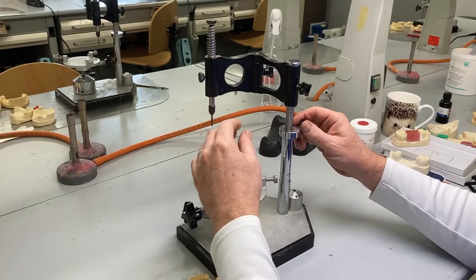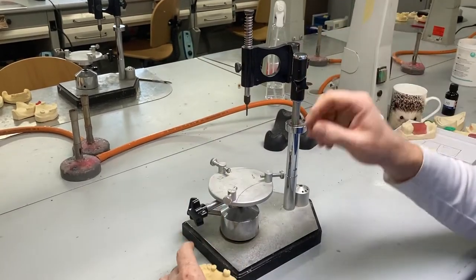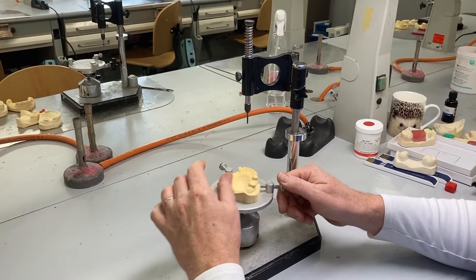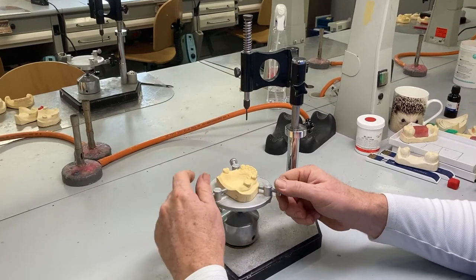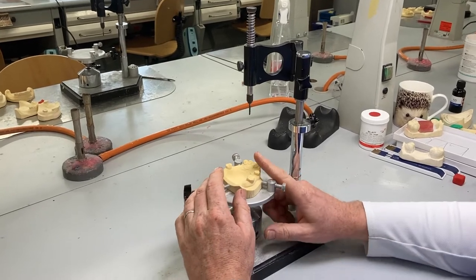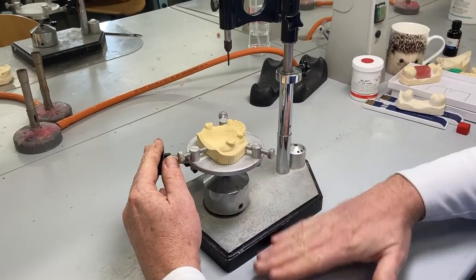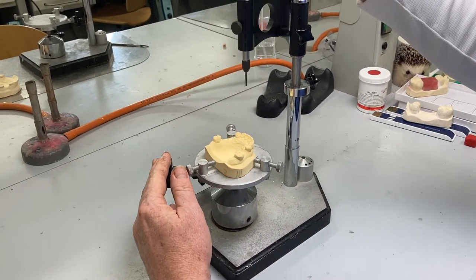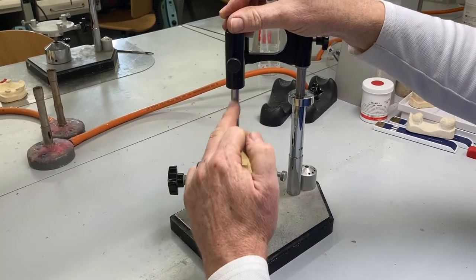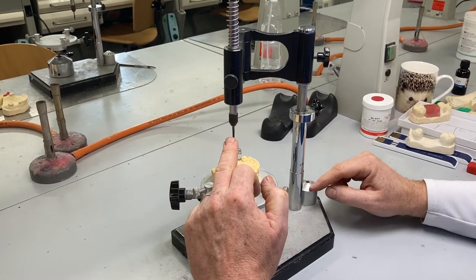When we're surveying a model, the first thing we do is survey relative to the path of displacement. The path of displacement is at right angles to the occlusal plane. This is the assumption we make about partial dentures — that the denture is always going to be displaced at right angles to the occlusal plane. So we put the model parallel to the bench top, and now our surveyor tool is at right angles to the occlusal plane, representing the path of displacement.